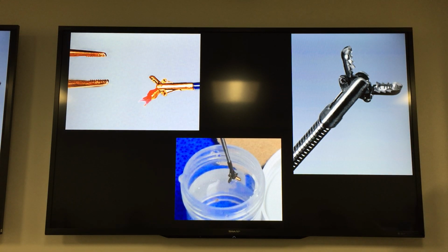So these big forceps can actually grab relatively large, for a forceps, pieces of tissue, and then they plop them right there in a small jar of formalin. So when you get a transbronchial biopsy, you'll get a small jar and small pieces of tissue in there. You have to be careful to grasp it gently if you're grossing it, because if you grab it tight, it'll squish, and it'll be all collapsed lung on the histology. So these are your alligator forceps.